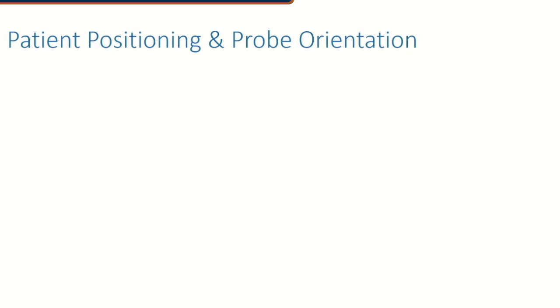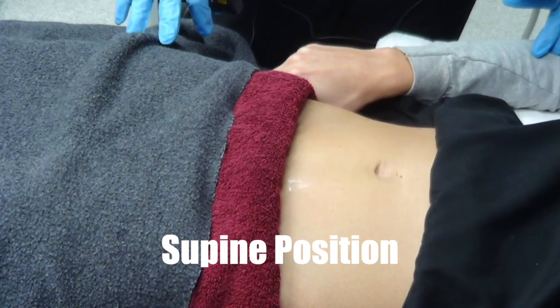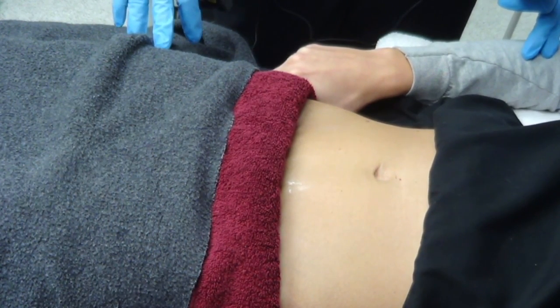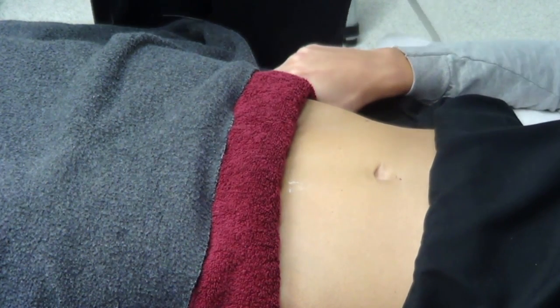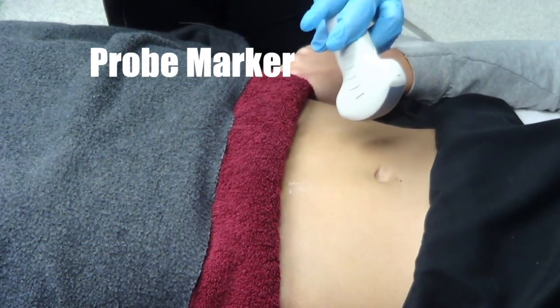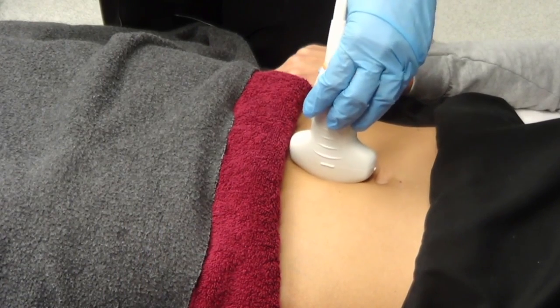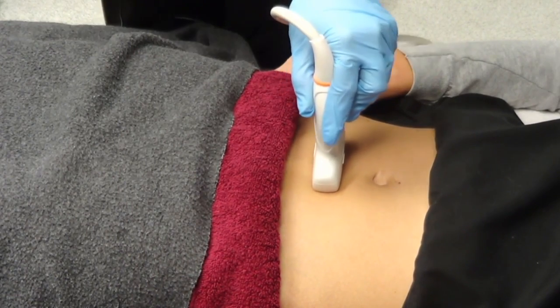So let's look at patient position. Your patient is going to be in a supine position. If for any reason it's a trauma patient that is off to one side or the other, you'll work with that. But if you can have your patient lie down in the optimal position, it'll be in supine position. Your probe marker by convention for any abdomen scan, which you can see here, must in long axis face up towards the patient's head. In short axis or transverse axis, we turn the probe or pivot 90 degrees counterclockwise so that the probe marker is pointing to the patient's right.